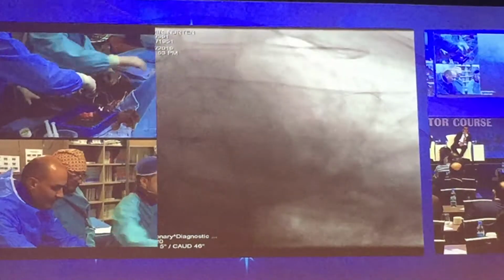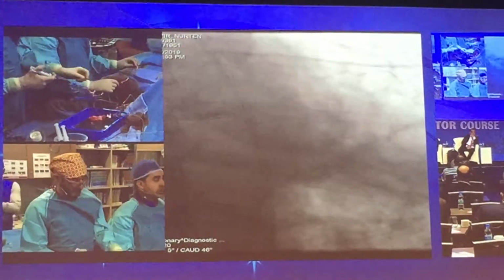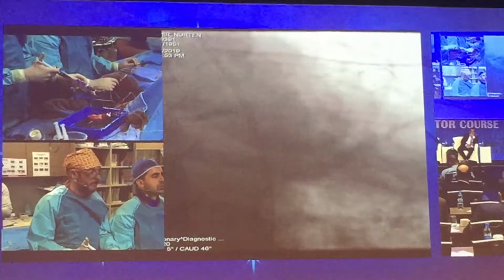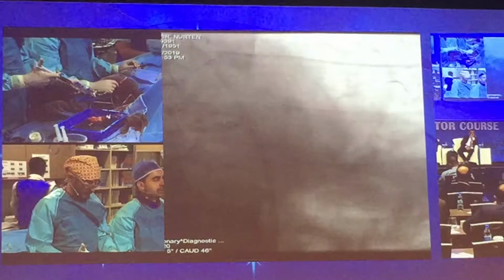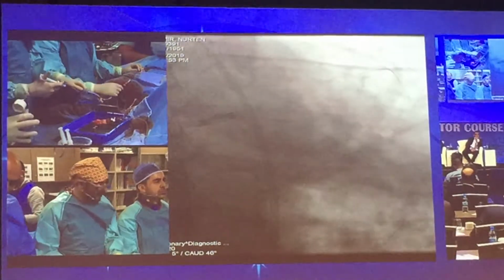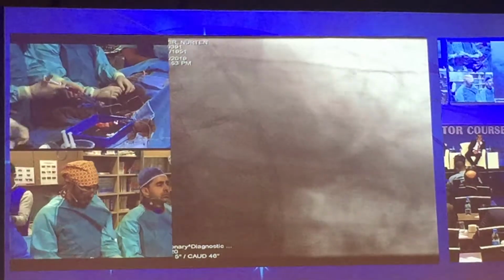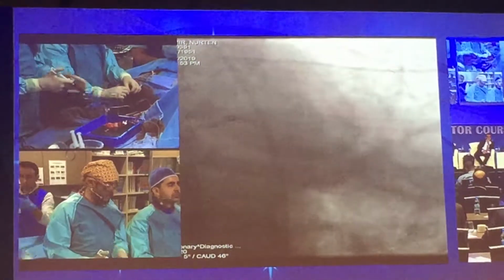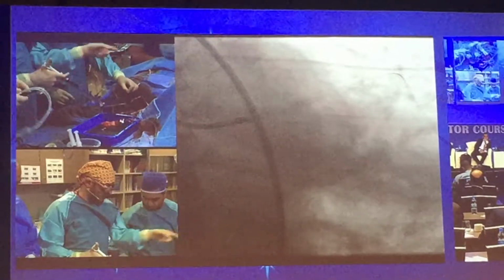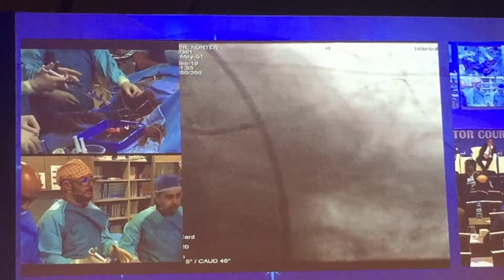You are taking off the regular gear, I think. The catheters, the wires. Al. Kontrast. Kontrast. Nihat açtın herhalde. Yok, kapalı. Okey. Film alalım mı? Bir film alalım. Görelim şeyi. Çektim, sağ çektim. Film.